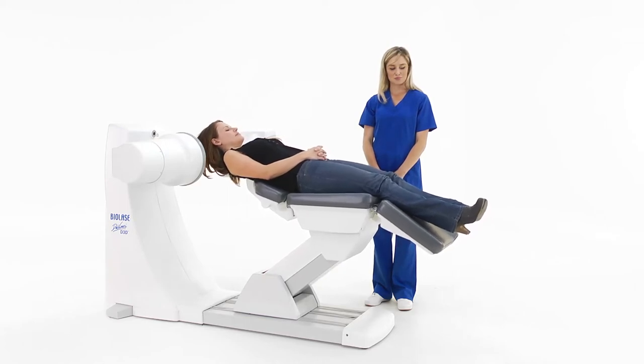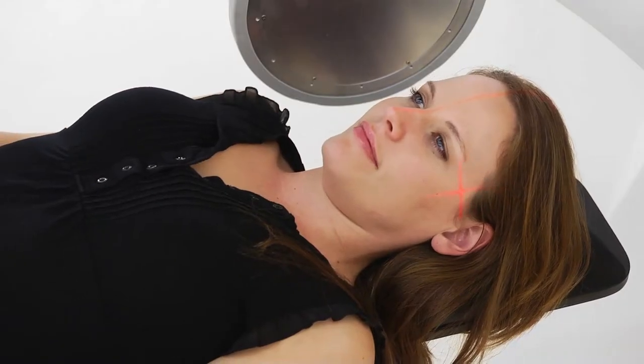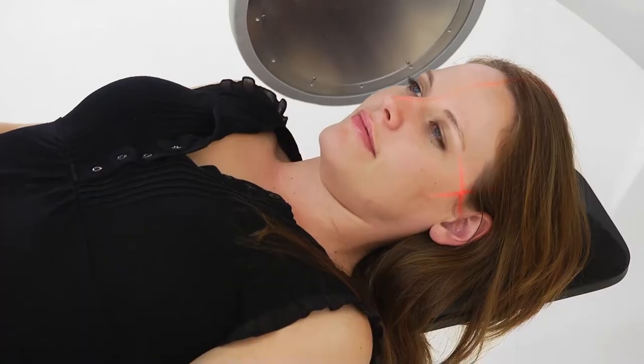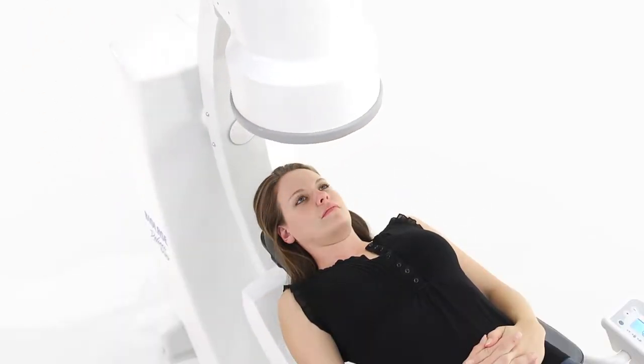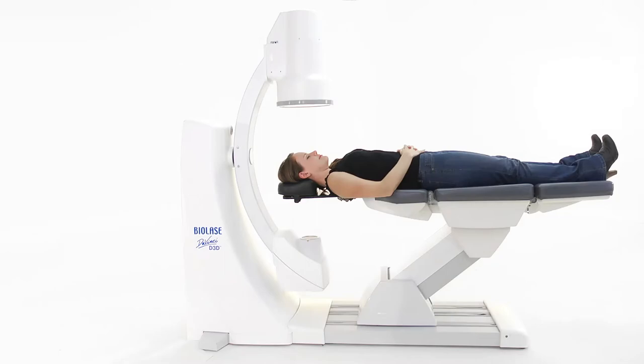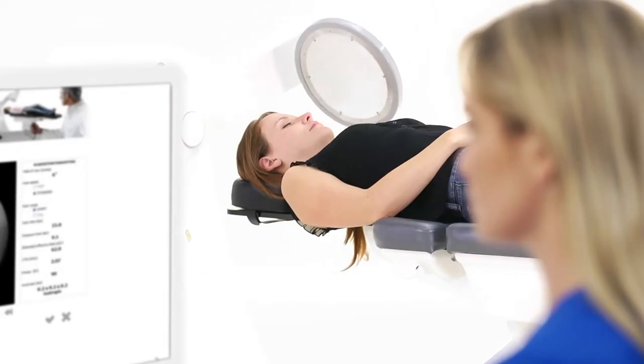The D3D lets you accurately position the patient in three axes, using three laser tracking beams for guidance. For even more precise alignment, scout images can be acquired for the D3D to automatically position the patient, resulting in a lower chance of having to retake the image.